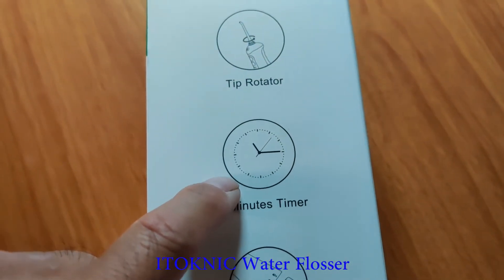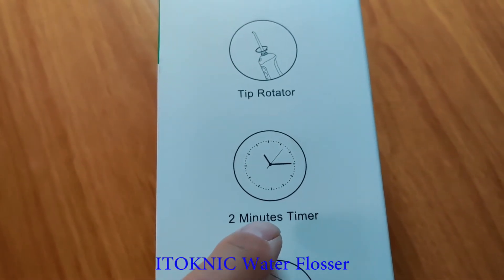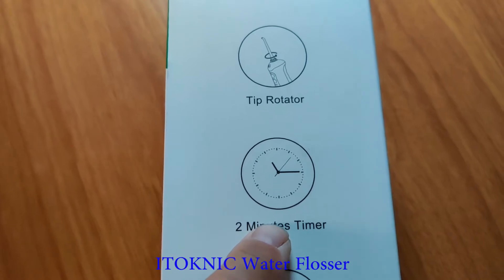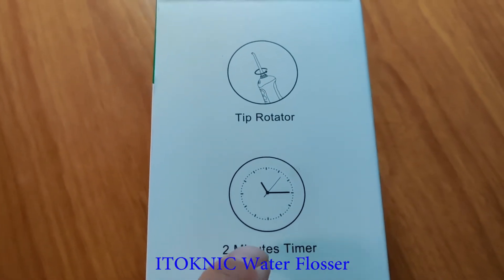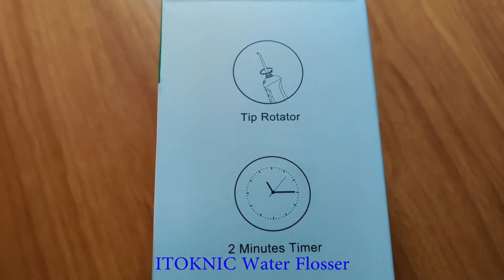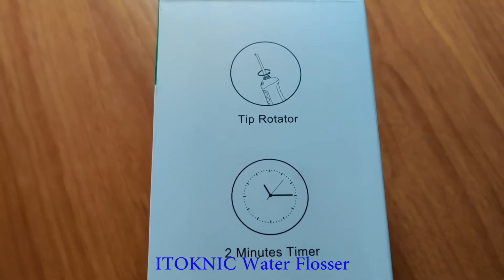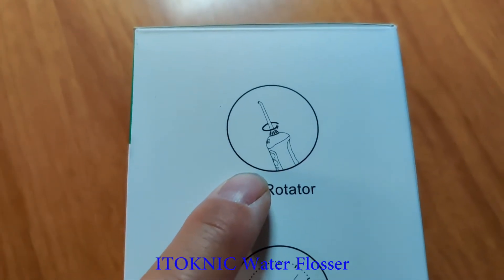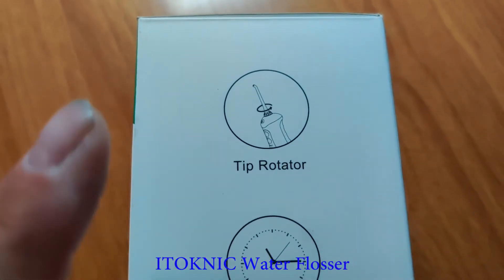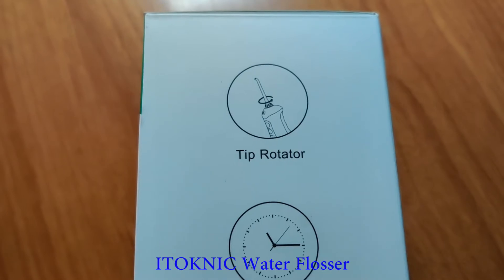There's a two-minute timer on here — it will keep going and then stop or pause at two minutes, just to let you know it's been spraying that long. Just like my other one at home; I believe that one has a 30-second timer. You can also rotate the tips, and you can switch tips between different people who use it. That's good.